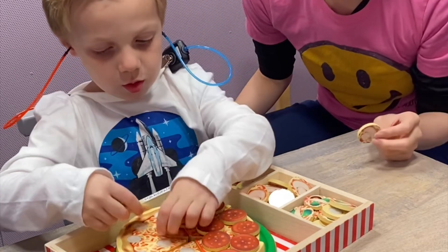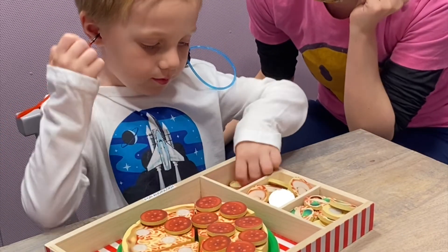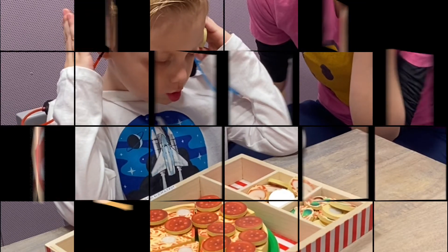He holds the toppings up to his ears. Once he hears the sound, he places the topping on the pizza. We can do this a number of times, or we can switch games if the child gets bored to maintain their attention some more.